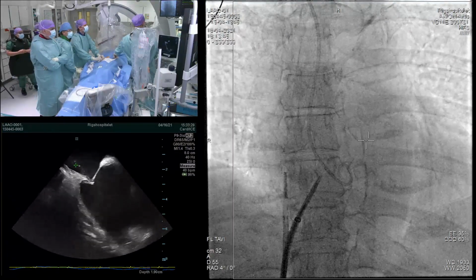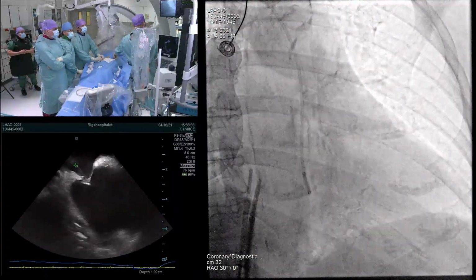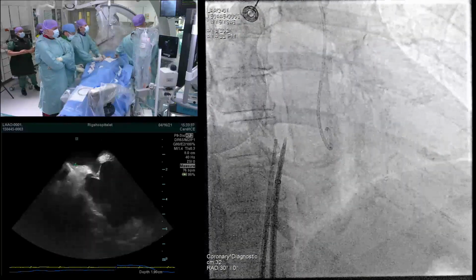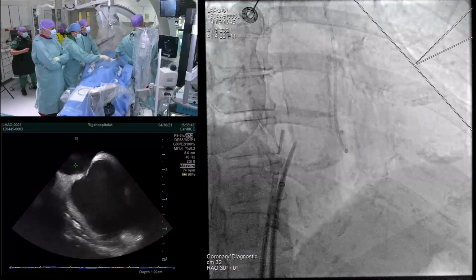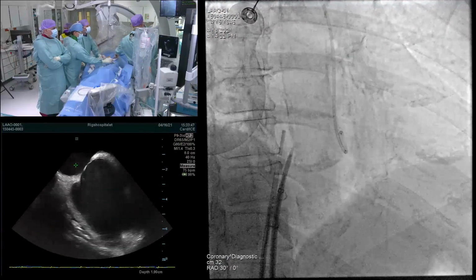This is in the middle of the septum. Yeah, okay, that's good. Then we want to go also inferior, so push the table a tiny bit maybe. So the question is, can we go more inferior? We like always to go as inferior as possible. I think you can go a bit more inferior. Okay, let's do that. Like that. That's it, I guess.